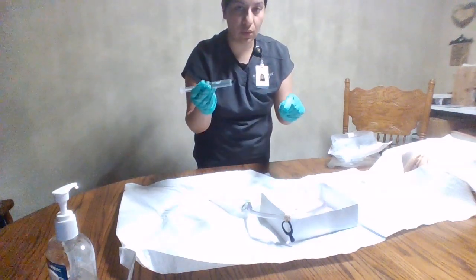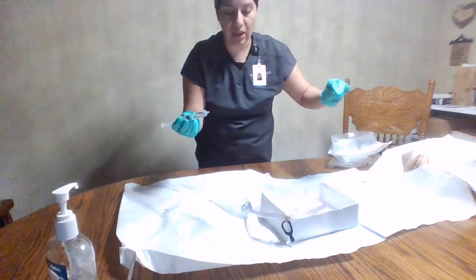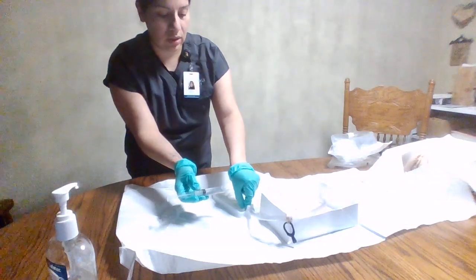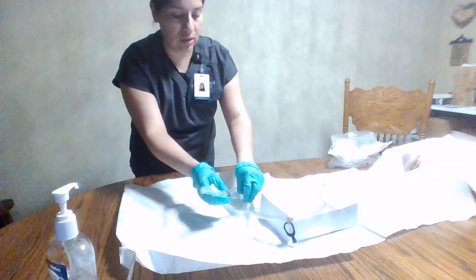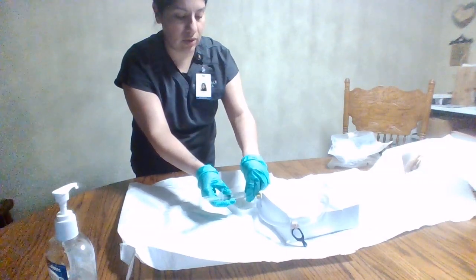And then with the syringe, I will go ahead and take off the black top, and I will insert it into the balloon catheter area.